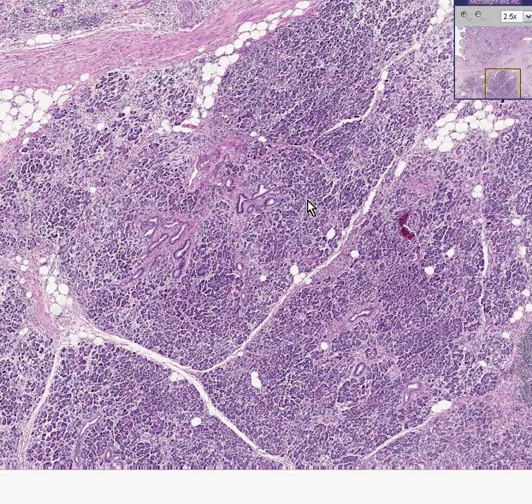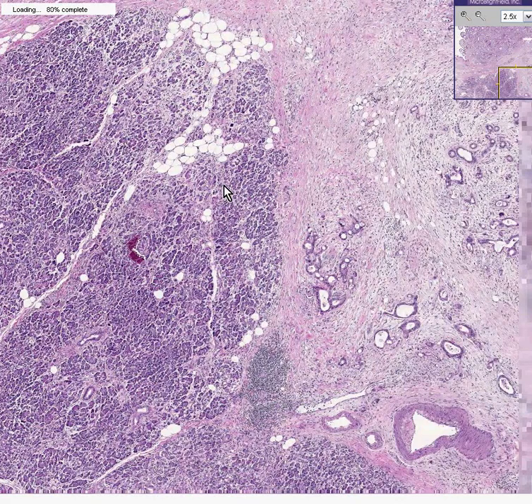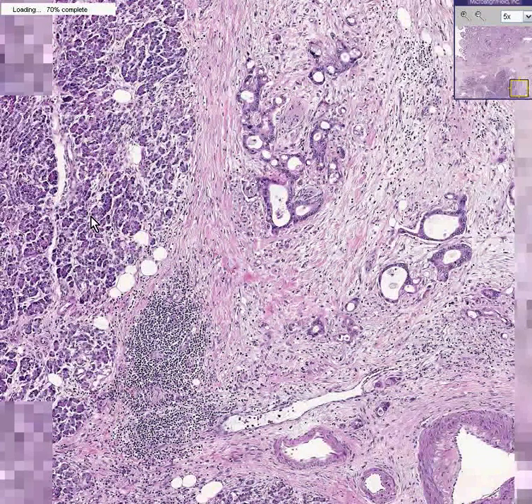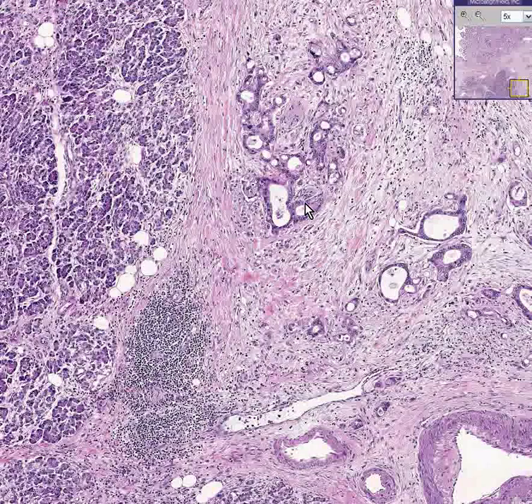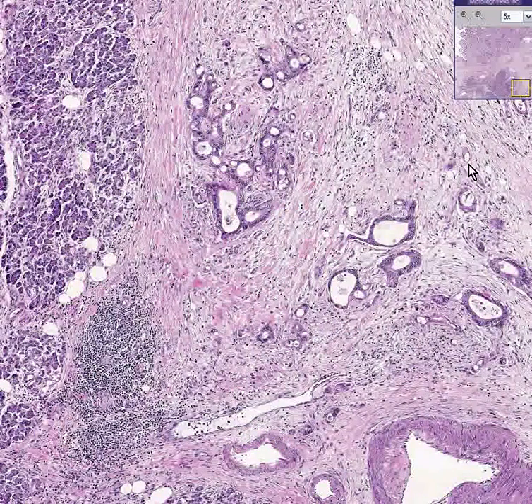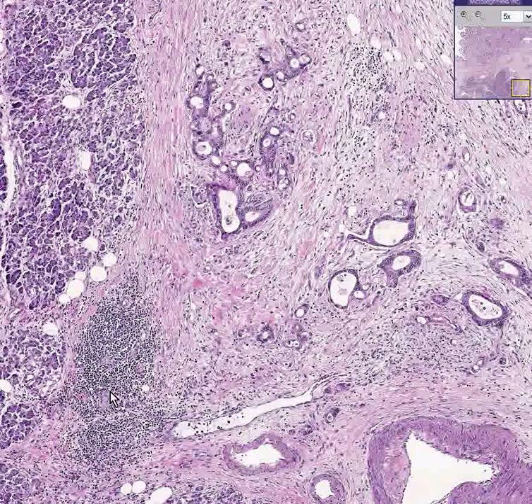If we move over, however, more towards that fibrotic or sclerotic area, I'm going to show you a beautiful side-by-side comparison here of a totally normal lobule with acini, as well as an area in which the glands are irregular and infiltrative and dark. And all of this stuff here is adenocarcinoma of the pancreas. There's no doubt of the diagnosis. Up here, it's all normal pancreas. There's no doubt of that diagnosis. And here, there's no doubt that there's some chronic inflammatory cells spattered between the two areas.